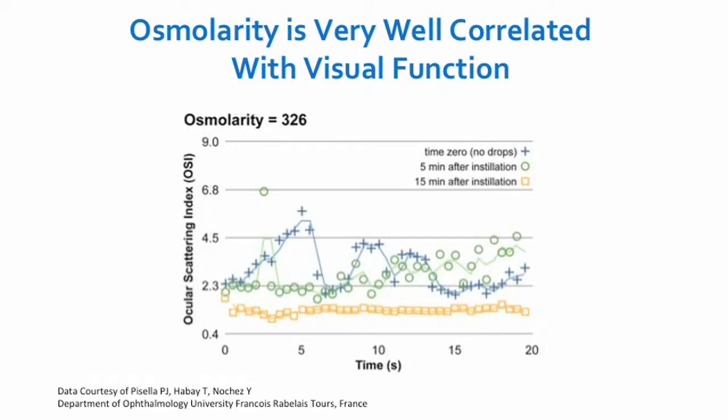They looked at the abnormal group, and as you can see, their ocular scattering score is all over the place. Then a drop of artificial tears was instilled, and after 5 minutes, you can see a lowering of the scatter and a tightening of the curve, and after 15 minutes, it was basically flatlined. All these tests require a pristine ocular surface. Otherwise, they're going to give high abnormalities, irregularities in the corneal topography, and aberrant readings in the keratometry to properly select an IOL power, as the phaco study showed.